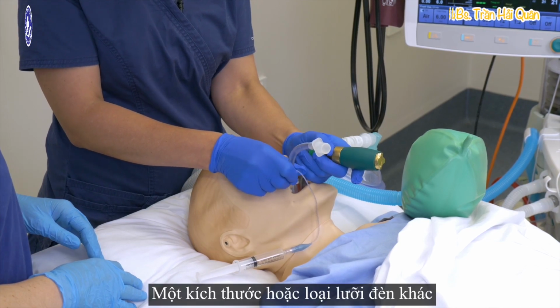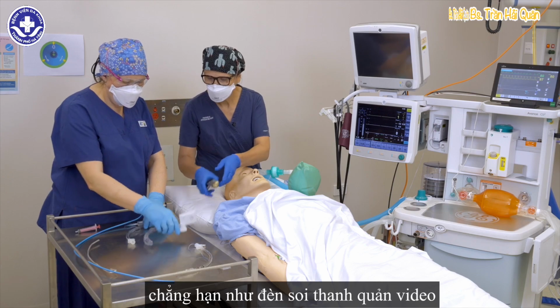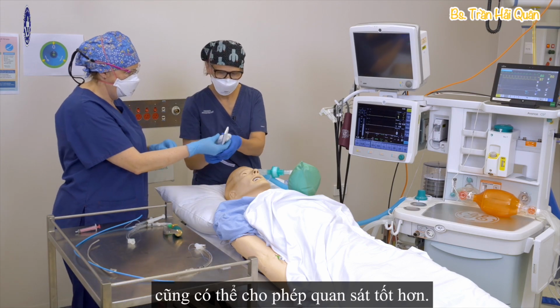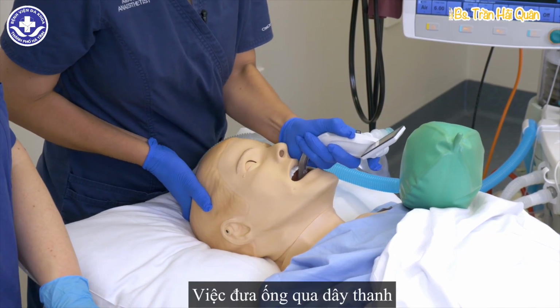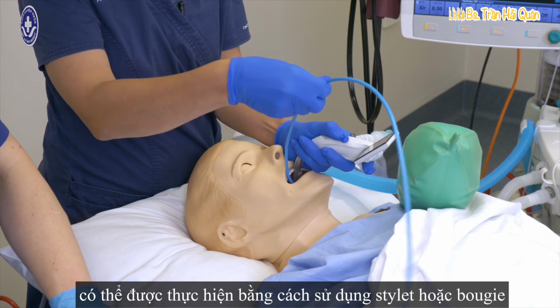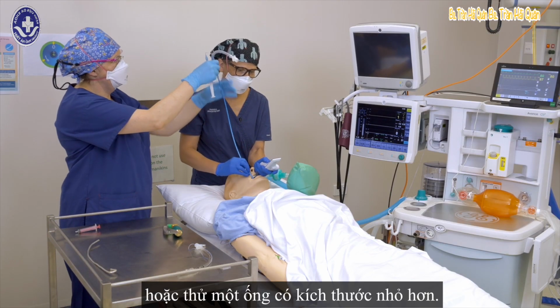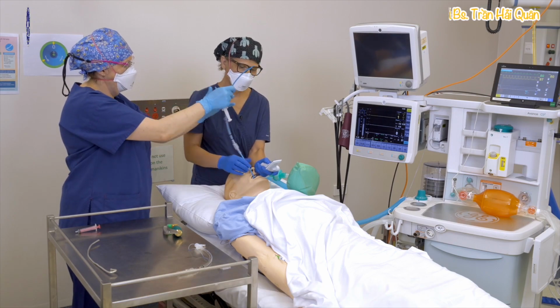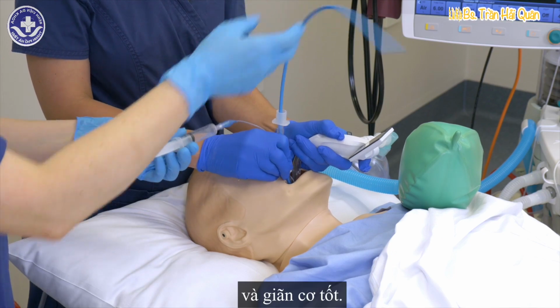A different size or type of blade, or a different laryngoscope, such as a video laryngoscope, may also enable a better view. Passing the tube through the cords can be helped by using a rigid stellette or bougie, or trying a smaller sized tube. As before, ensure that the patient is adequately anaesthetised and paralysed.